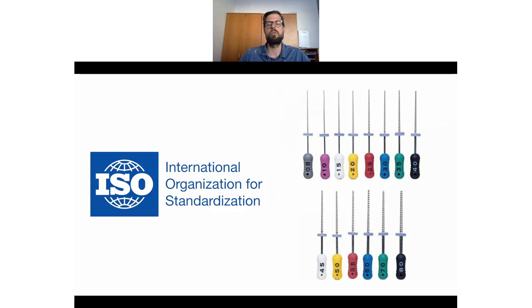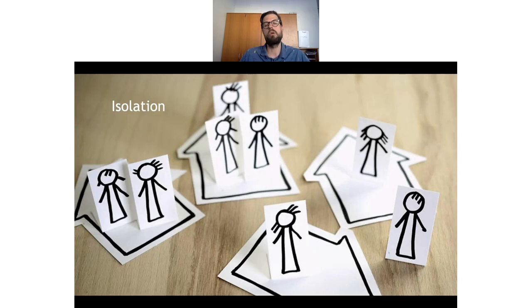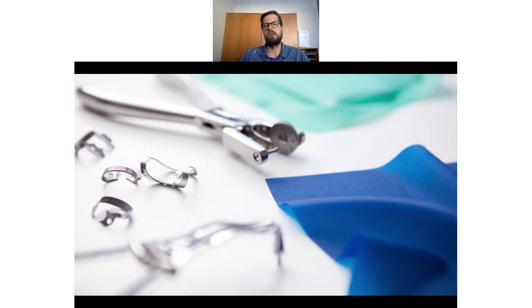So for me, when I tell you this kind of cases and everything that I tell you, I have my standard, and it is important that you have the same standard, because otherwise I will have other results, and you will have other. So first of all, isolation. Nowadays a very popular word, but I work in isolation with the dental dam. You can use dental dam.